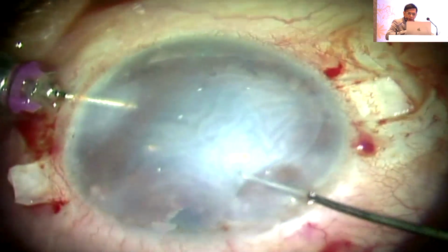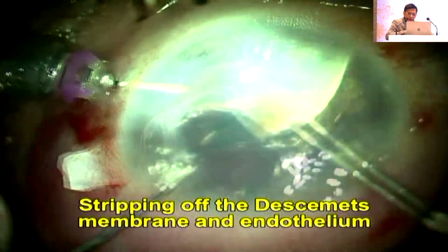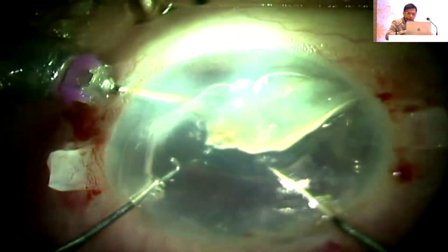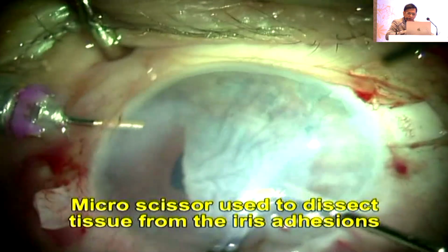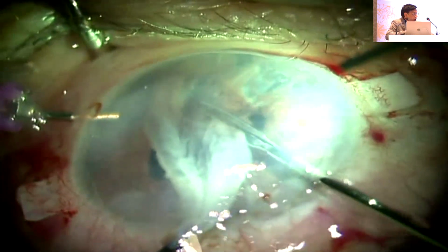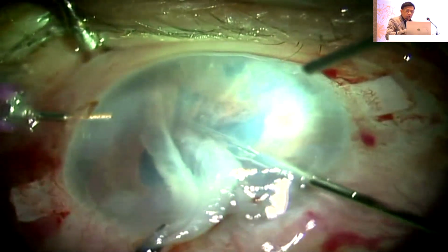So I'm doing a vitrectomy. You can see the trocar AC maintainer there. I couldn't see clearly, so I'm taking off the Descemet's endothelium complex there, and you can see that fibrotic tissue is stuck to the iris. So one hand is holding the fibrotic tissue, other hand is cutting with a scissor.